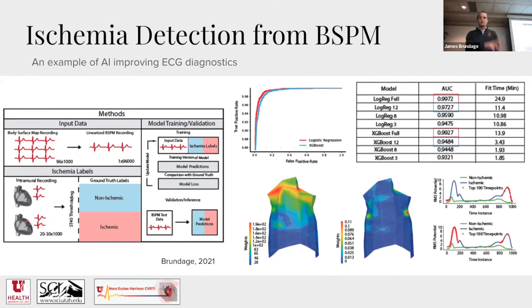Yeah, absolutely. So this data set in particular came from an experimental data set where we used a large animal model and we're actually able to control the degree of ischemia. And so our ground truth was based on, okay, we controlled ischemic versus not ischemic. However, you're absolutely right that in the patient setting, we have to be conscious of models that make a decision and what the impact of that decision will be. And I know there are groups who, for example, will differentially weight their loss functions such that even if the two diseases are both wrong, it will give partial credit to the one that gets you closer to the correct treatment, right? So absolutely, that's essential to consider, especially the closer you get towards clinical implementation models.